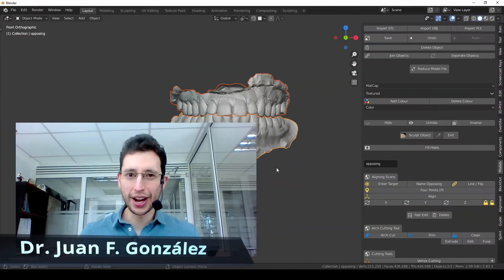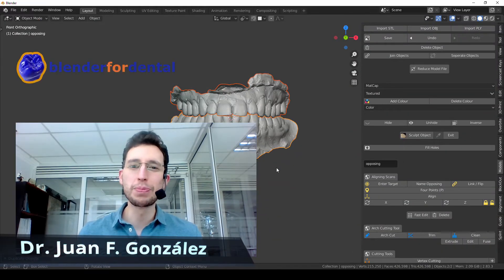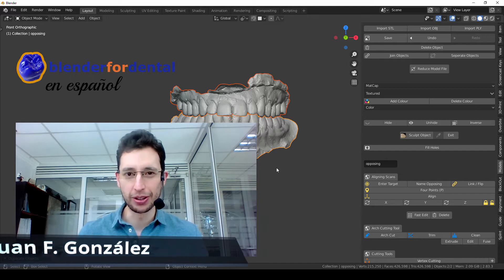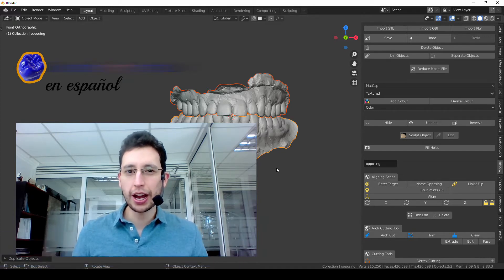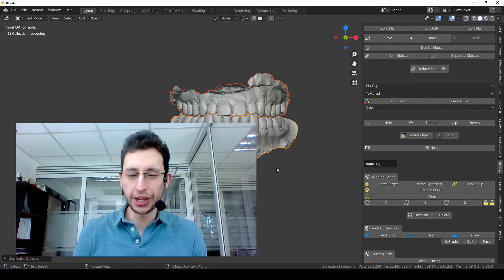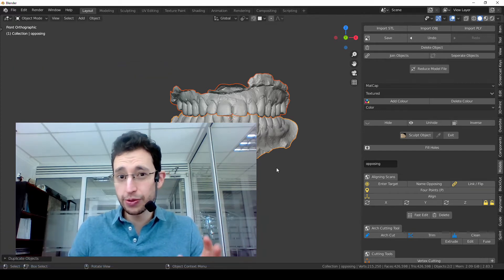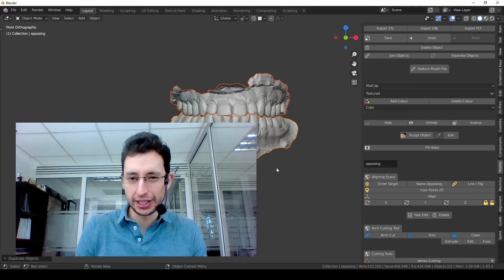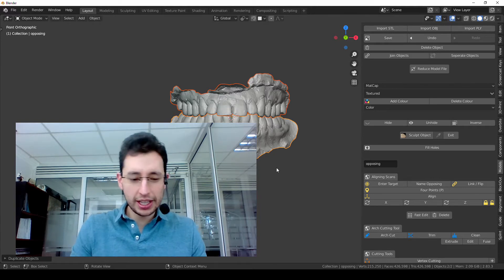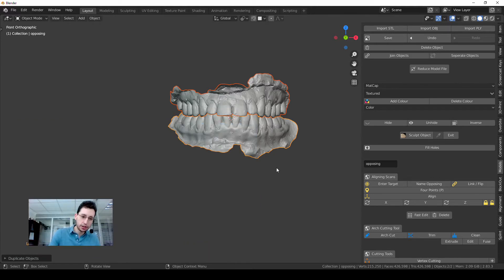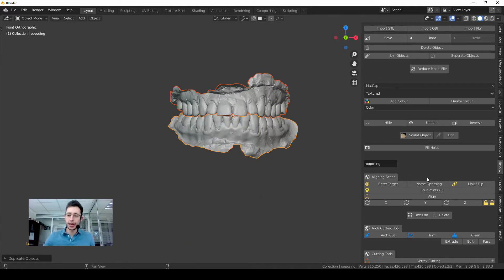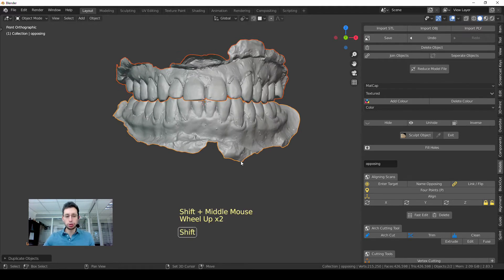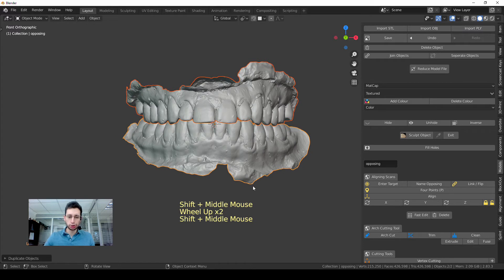Hello everyone, welcome back to Blender for Dental en Español. Today I have a very short but very useful video. If you want to print models, we're going to see how we can hollow the models using the model designer module. It's very easy, so this is going to be a short tutorial.